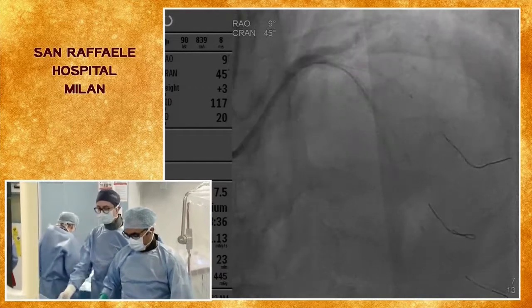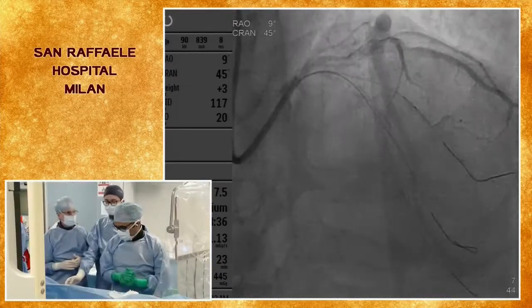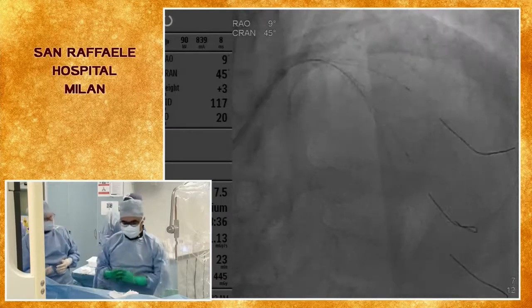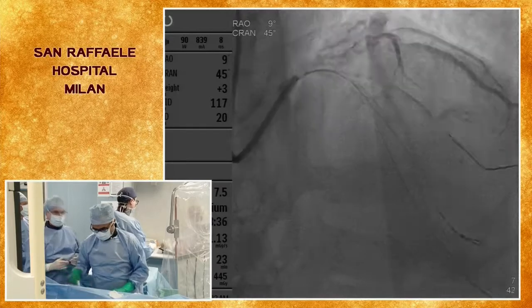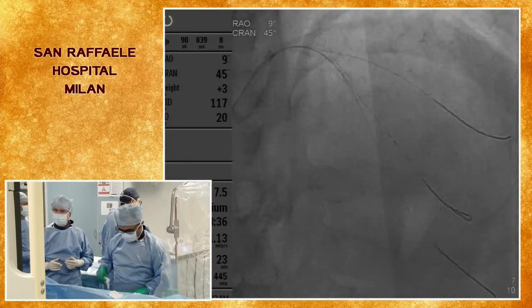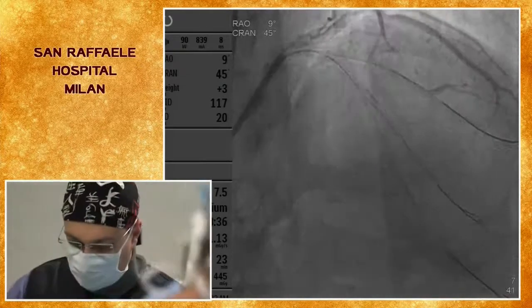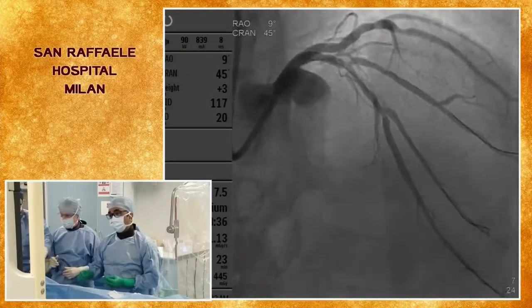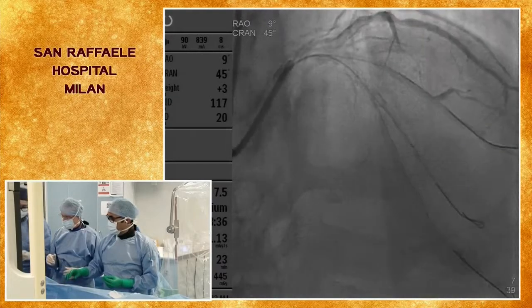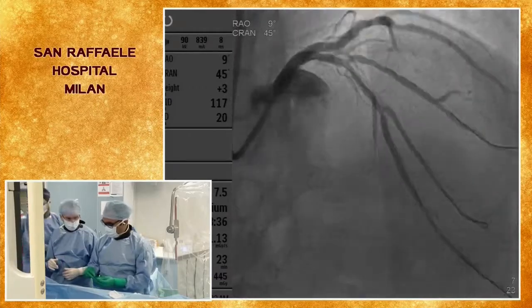In this room, we use Onyx, Medtronic. In the other room, we use Terumo. Right. So that's our reasoning. We may consider to do drug-eluting balloon in the distal portion, but again, let's see how it goes. The provisional will come after we do kissing and after IVUS.